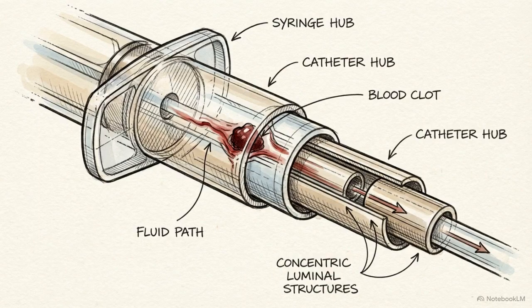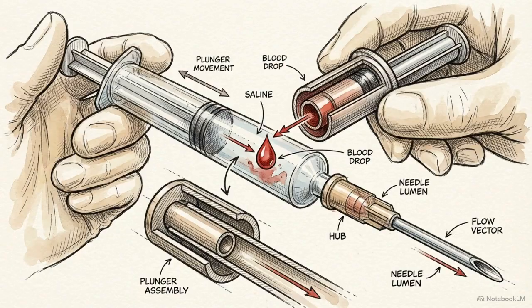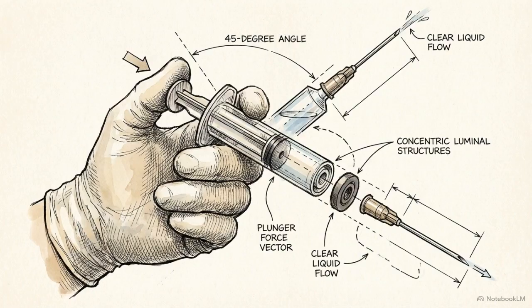Between these injections, the coaxial lines must be cleared of internal clotting. For procedures below the clavicles, the standard protocol is the single flush, aspirating until 1 drop of blood enters the saline syringe, tilting to a 45-degree angle and pushing the saline forward.